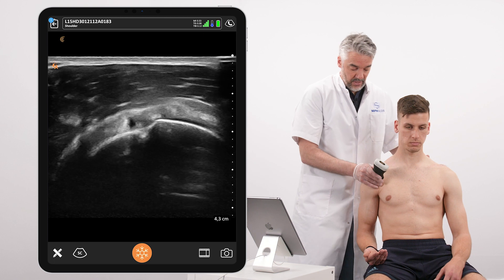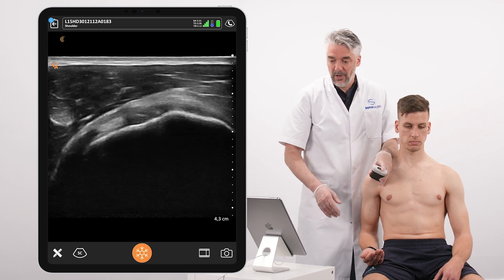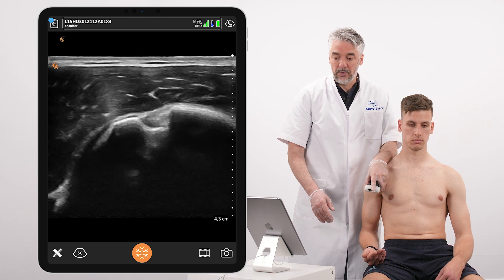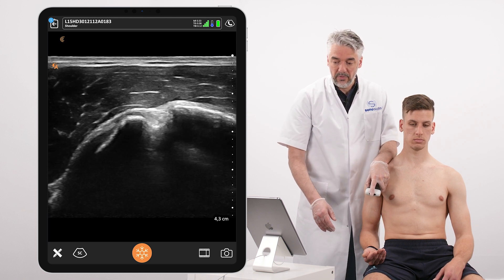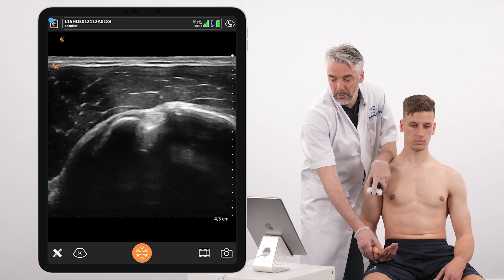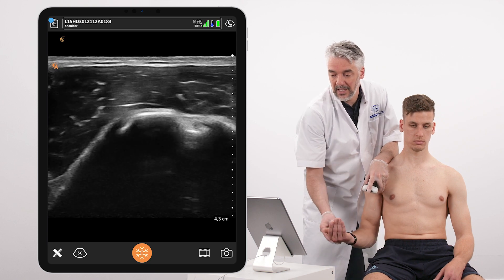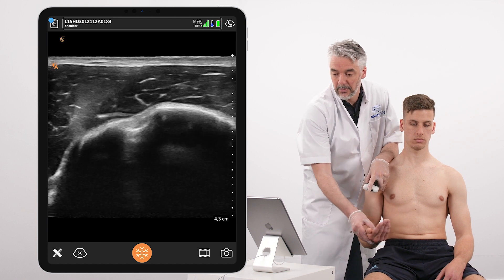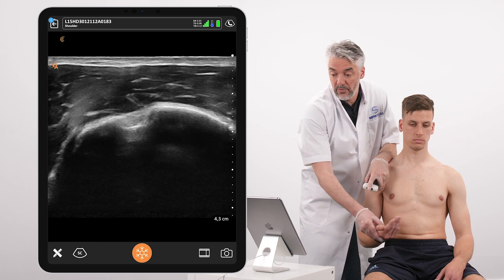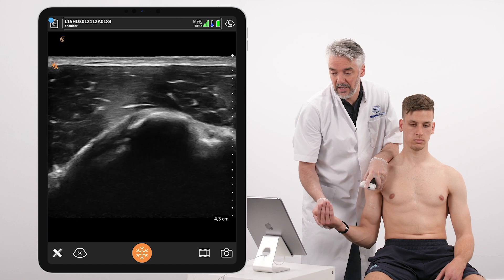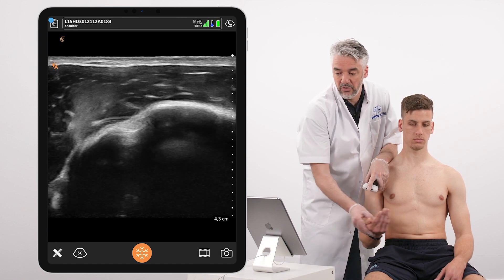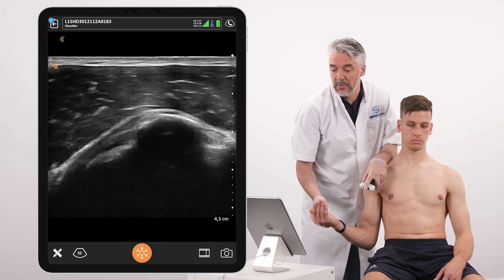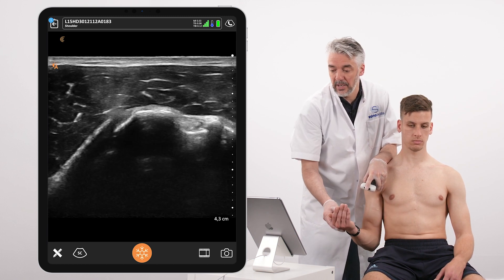Turning the patient back, we follow the biceps back to the intertubercular groove and now look for stability within the groove by performing external and internal rotation. We can see that the biceps remains within the groove and is not luxating or dislocating during this movement, which is also a healthy sign.